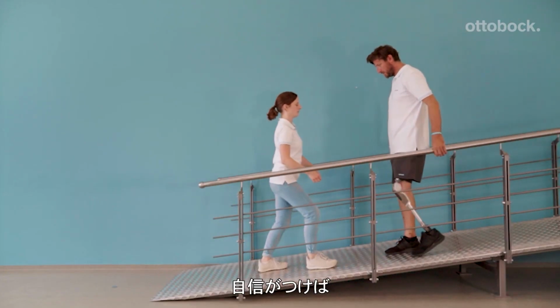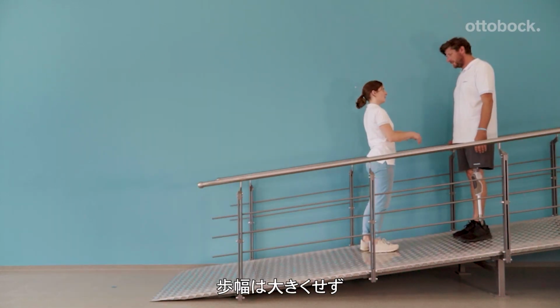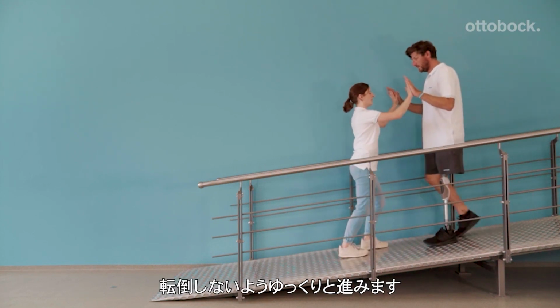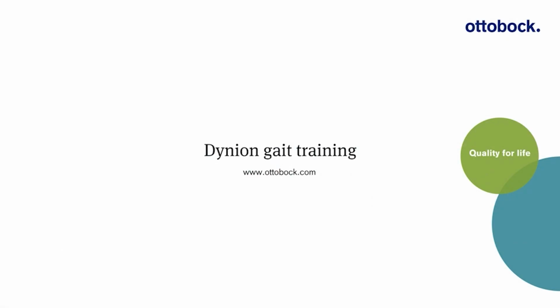Change the side of the handrail as confidence increases. The steps should not be too big. Our model might go too fast and would risk to fall. An adjustment of stance flexion resistance might be necessary by the CPO.